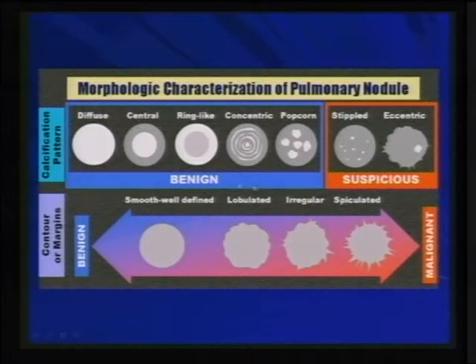The contour of the lesion obviously is very important. If it's spiculated or lobulated, this is most likely to be a malignant lesion, but of course, we're still left with those indeterminate nodules for which there is no calcium and there is no contour characteristic to tell you it's benign or not. I just want to emphasize that you can characterize the nodule by doing targeted scanning. That allows you to see more or resolve more the nature of the lesion, its contour and its content.